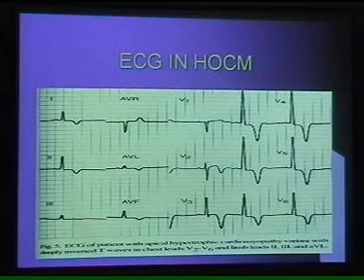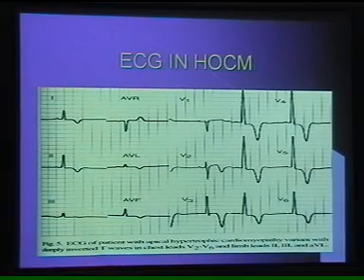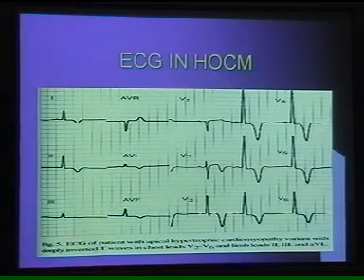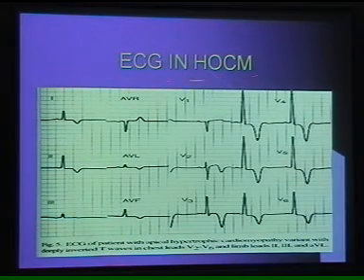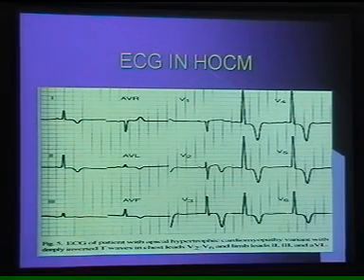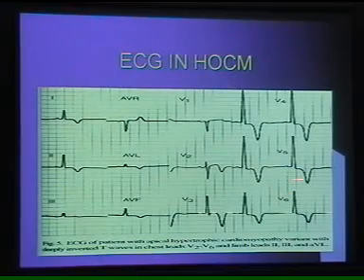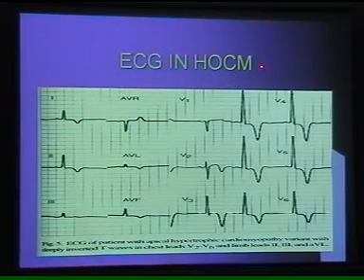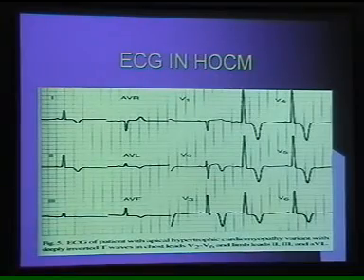But if they are present in very young people without any history of previous pain or acute chest or heart attack or pain or a family history, then one should think of the possibility of a hypertrophic obstructive cardiomyopathy, and family history would support that. So that would be the pattern which should alert us to the possibility of this type of abnormality. Next one.